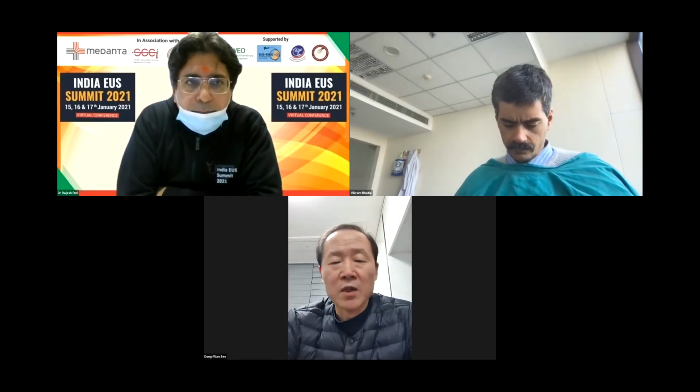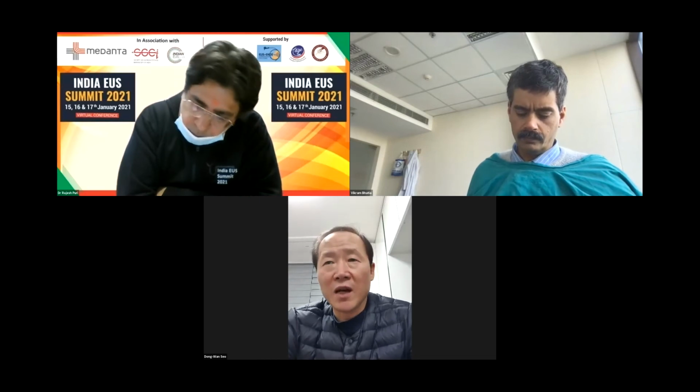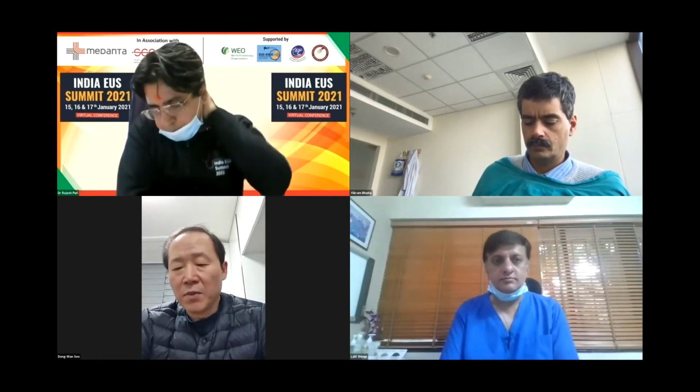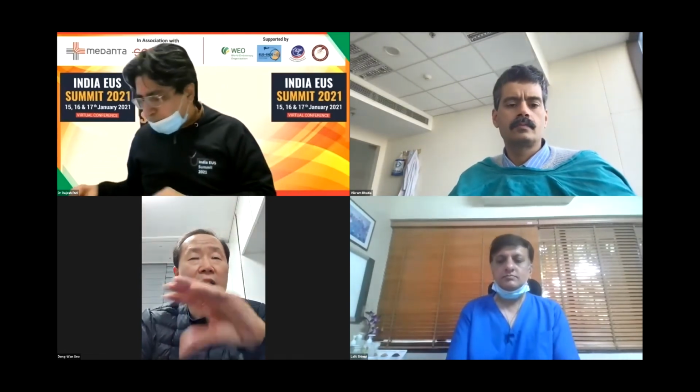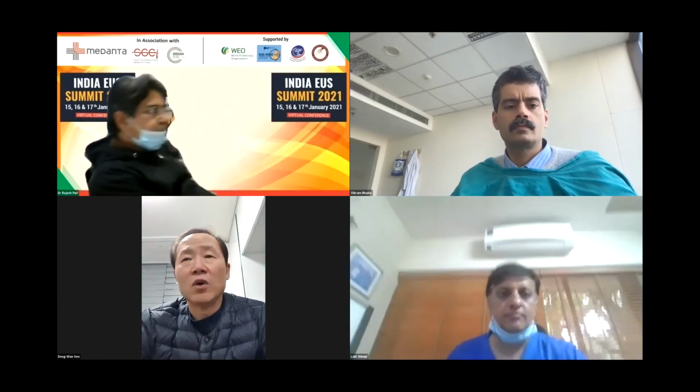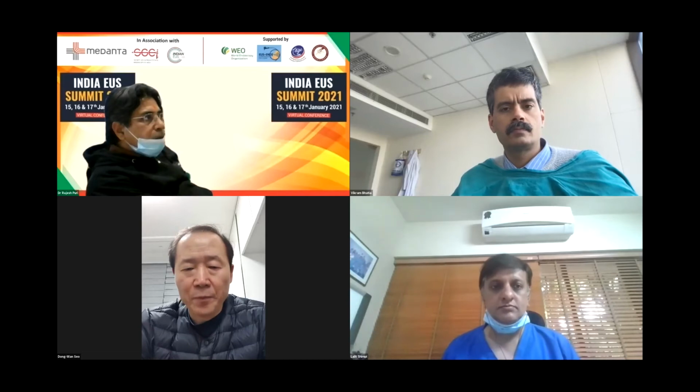Okay. So when we checked the recurrence rate, once complete resolution was achieved, just 1.7% showed recurrence, even after 10-year follow-up. So we think this EUS-guided cyst ablation therapy can be a very good option for patients with pancreatic cystic tumor, but careful patient selection and tailored intervention is necessary because we want to avoid unwanted complications, and also we want to increase the treatment efficacy. Thank you very much.